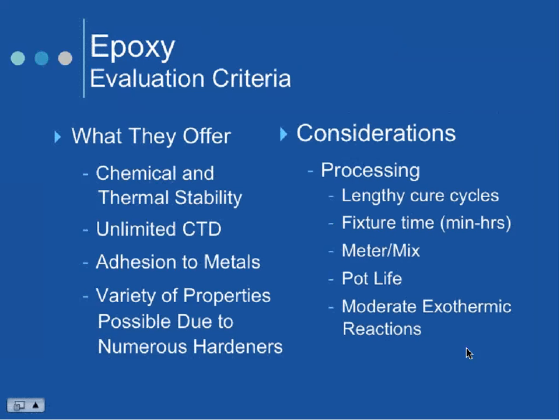Considerations. It's always kind of the processing side. That's the part that you have to contend with, that nozzle, that mixing, making sure you don't have off-ratio material, and then taking care to make sure the pot life is still enough so that you can use it. The clock starts ticking the minute it comes out. You can have a 5-minute work life, you can have a 120-minute work life until it doubles in viscosity, and at that point, that's when we say it's really not usable.